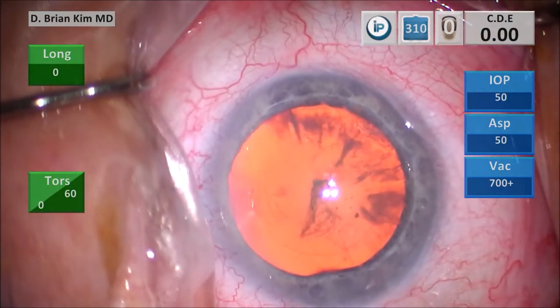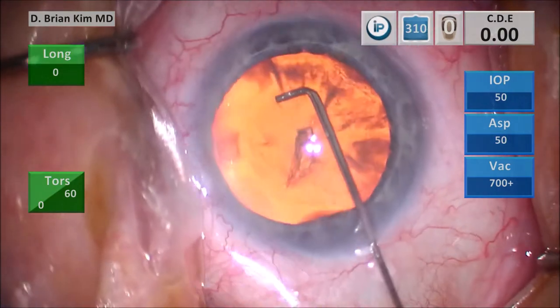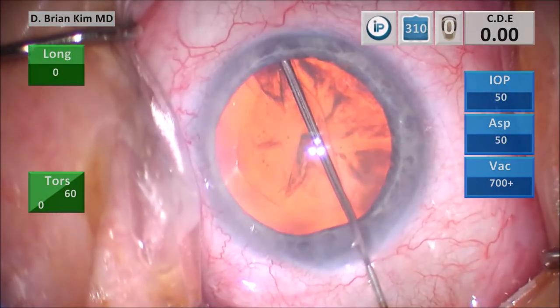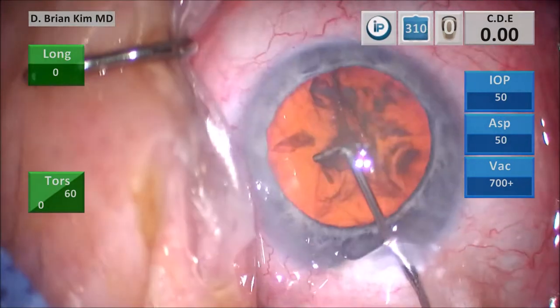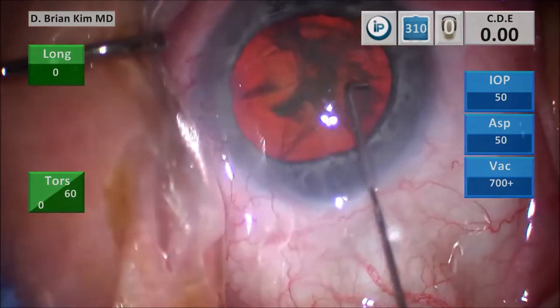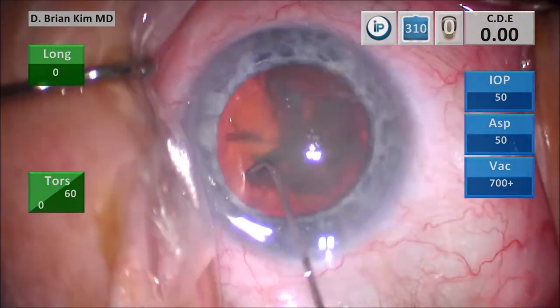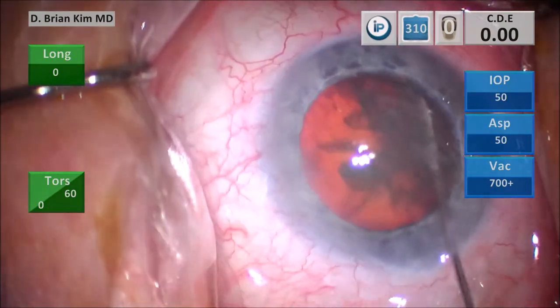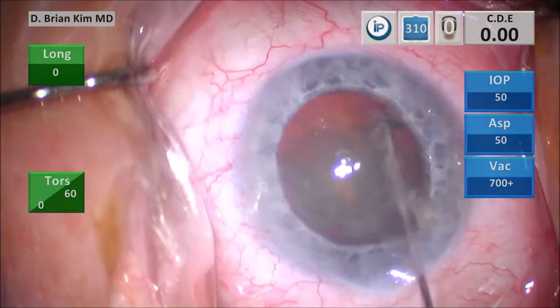This is a capsular fornix hydrodissection technique. I place the cannula out underneath the rhexis edge, contra-incisional, point the tip down, get a nice fluid wave, decompress the bag, and then on the right side. Very carefully, I'm going to try to spin the lens. This lens doesn't spin very freely, which is a sign that perhaps this lens is stuck to the bag or there are some weak zonules.